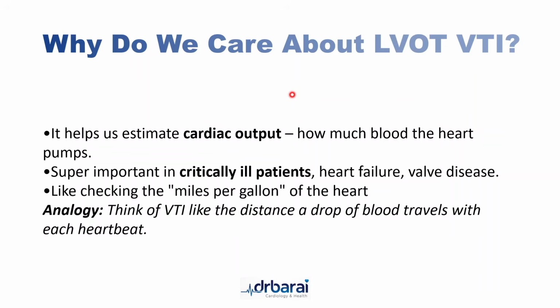Think of the LVOT VTI like the distance of a drop of blood that travels every time the heart beats. Obviously, if there is some pathology in the heart, like a heart attack or a cardiac tamponade, or if the patient is in a shock or is in heart failure, this distance that the blood is pumped will be reduced.